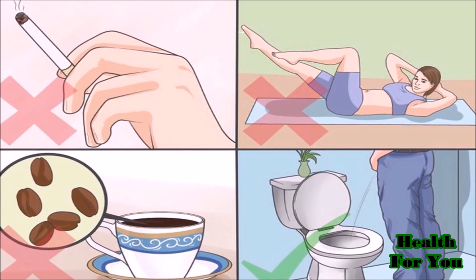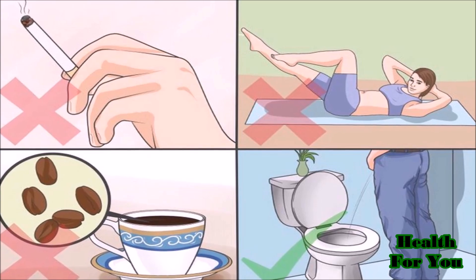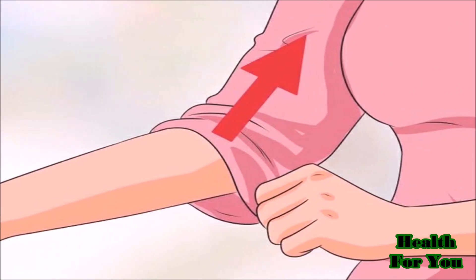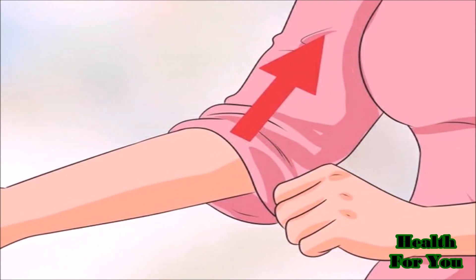Also avoid a full stomach, a full bladder, caffeine, and some medications. Remove excess clothing that might interfere with the BP cuff or constrict blood flow in the arm.